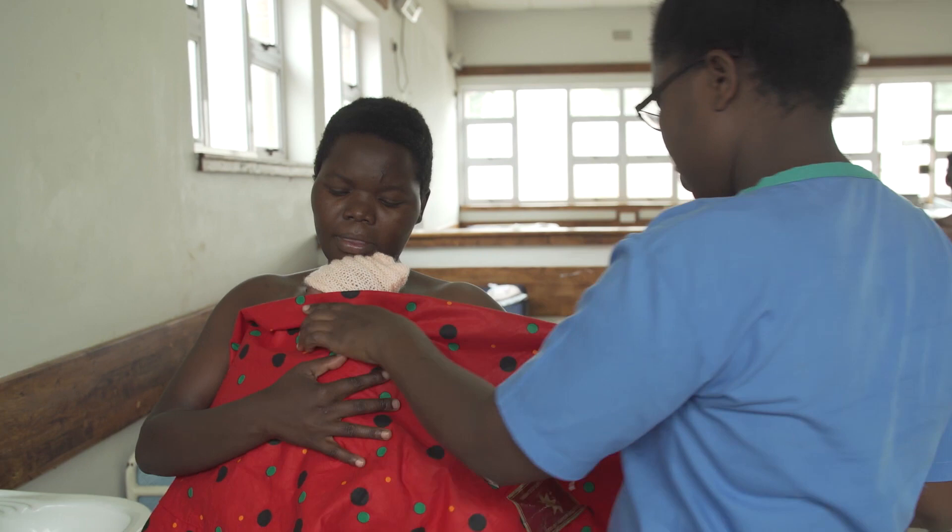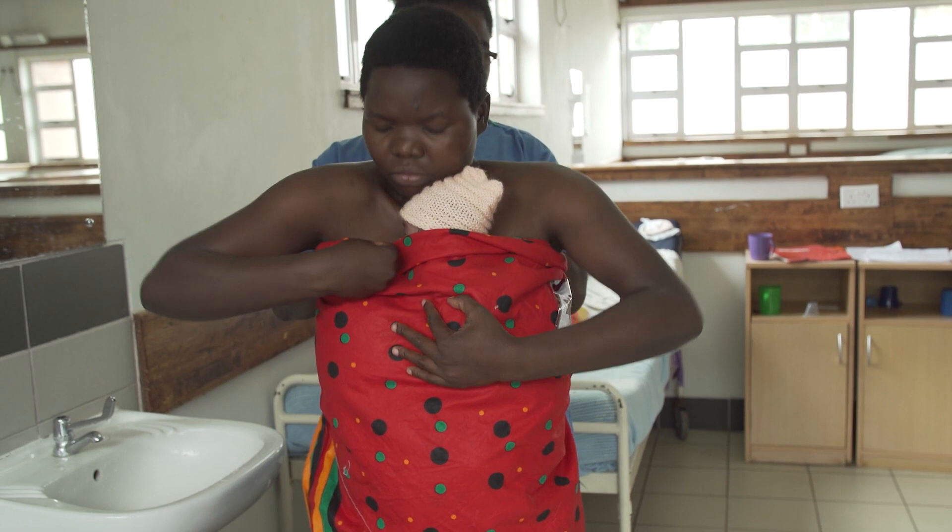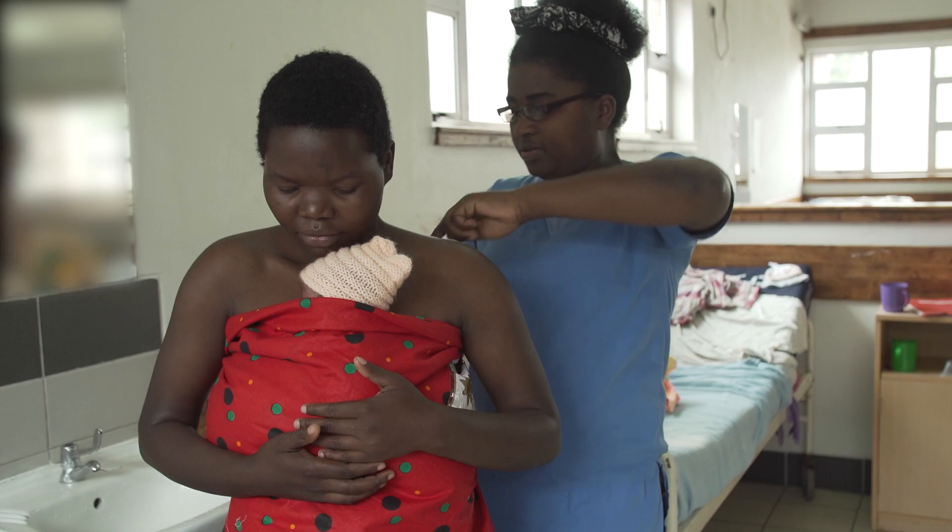Once off the warmer, the baby should ideally start kangaroo care straight away. You need to check the baby's temperature 30 minutes after they are taken off the warmer to ensure that they are maintaining normal body temperature.